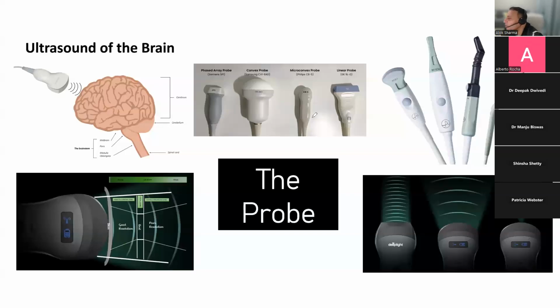So again, the kind of probes that we commonly use, we use the C58 in our setup. But if I want to look at meninges, I've got a linear probe, and it takes a frequency up to 15, which is really good. So I can increase the frequency. I rarely need to use more than 12, unless I'm really looking at some of the vascular structures. If you have a convex probe, an abdominal ultrasound probe, you're most welcome to use that. If you don't have that, then you might have to use a phased array probe. And just remember that a convex curvilinear probe is going to give you this view, but a phased array probe is unfortunately only going to give you this view. And that means that you'll be limited to a straight image.